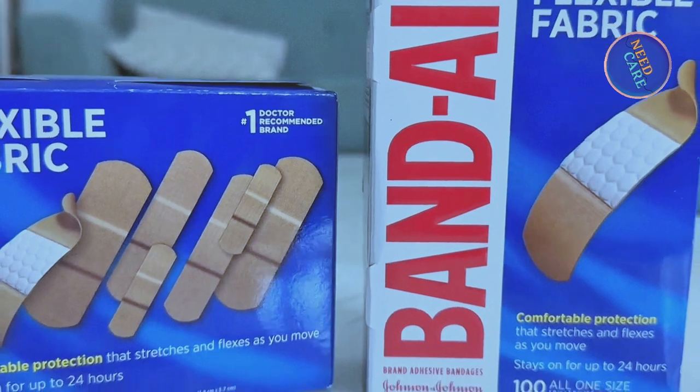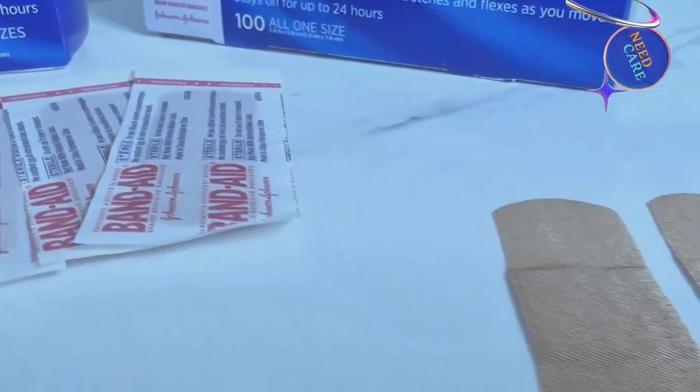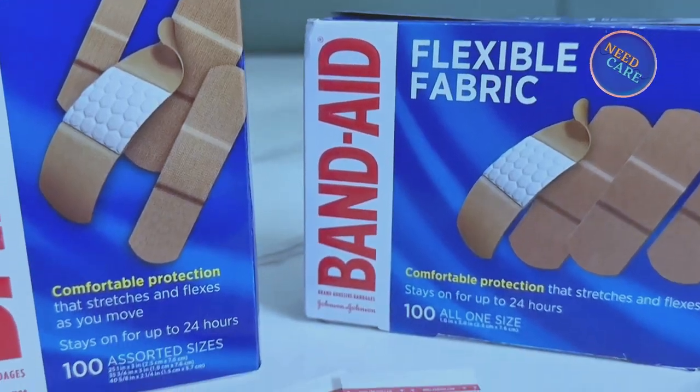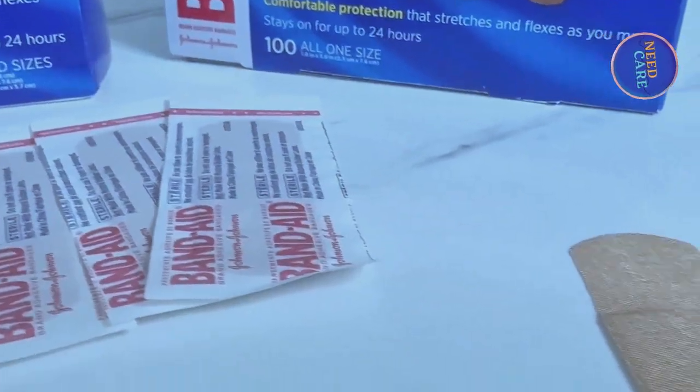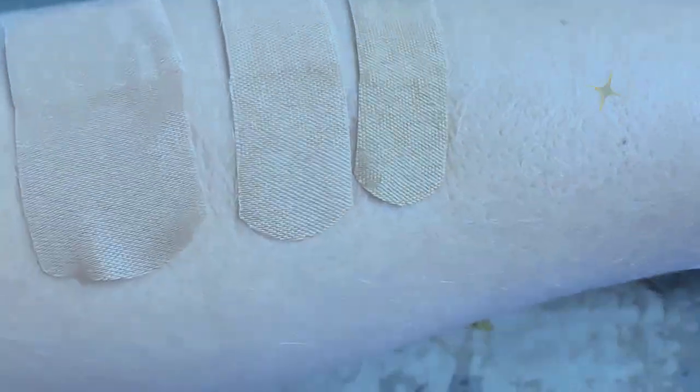So you do have these two options. The sizes aren't too dramatically different, so I don't think it would be worth the extra money to go with the variety pack. I personally would prefer the one size because they're just large enough to cover everything and you're not going to have to pay extra. They both come with 100 band-aids in each box. They are great band-aids — they're going to stay on for up to 24 hours and I love that they have that flexible fabric. These band-aids are a must-have for any classroom, home, or first aid kit. I love my band-aids and I hope I've sold you on them.